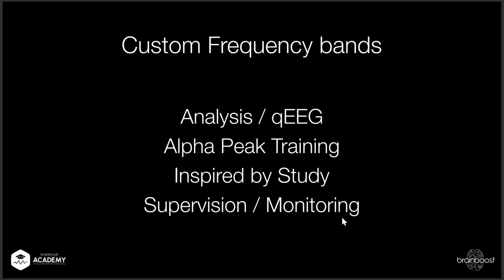And if you supervise or you monitor a session, you might want to say, I want to train SMR training, but I want to see a certain custom frequency band and just monitor that. Not necessarily train it, but have a look at it.